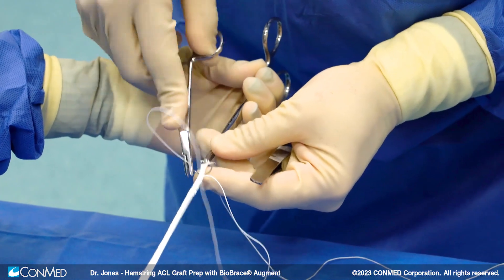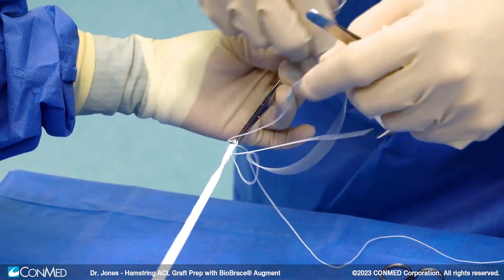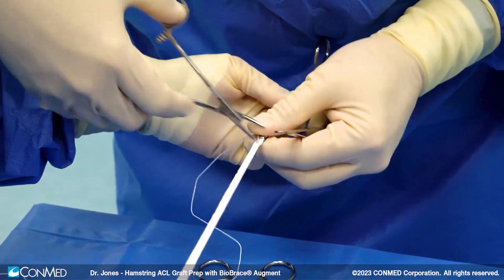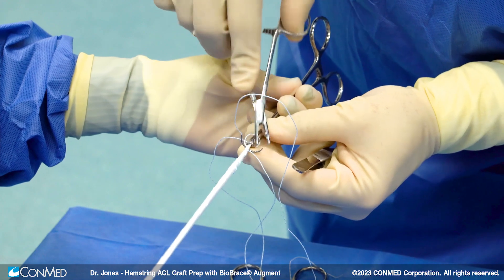I keep the biobrace to full length and we'll cut it off later on. I usually keep the full length the entire time and remove the tissue at the end. So we take the alice clamp off here and flip it around in the same fashion as before. The biobrace is actually very good at augmenting any extra-articular procedure as well, such as the MCL or posterolateral corner.